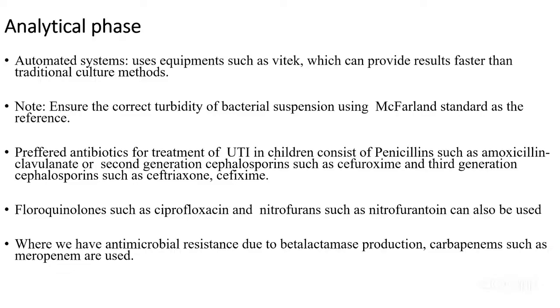Then we have automated systems where equipment such as Vitek is used to provide the results. This one is a faster method, and it's not as tedious as the conventional method. For both the conventional and the automated method, you have to ensure that you have a standard bacterial suspension, which is measured against a McFarland standard as the reference. Ensure that the turbidity is within the ranges so that you will not have a false resistance or a false sensitivity.